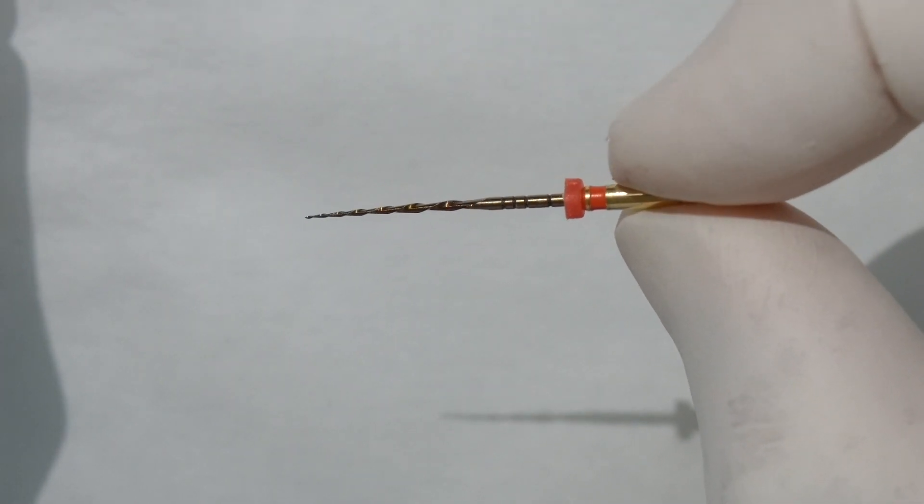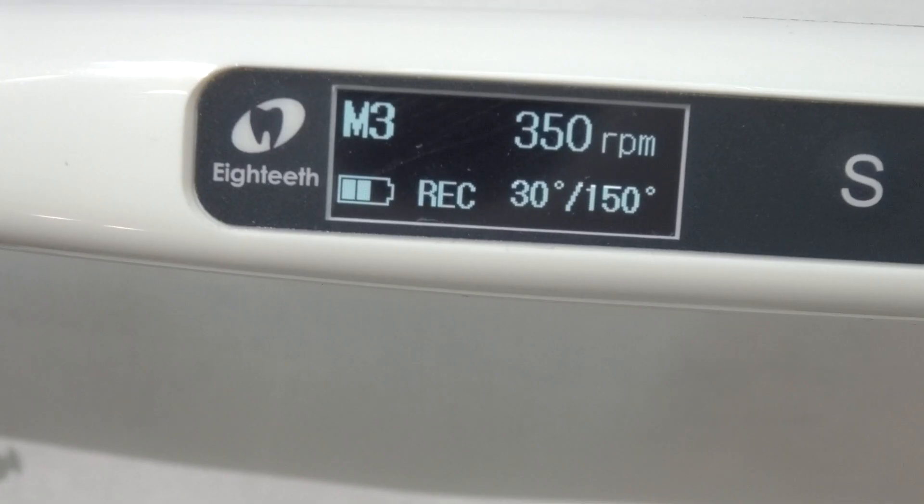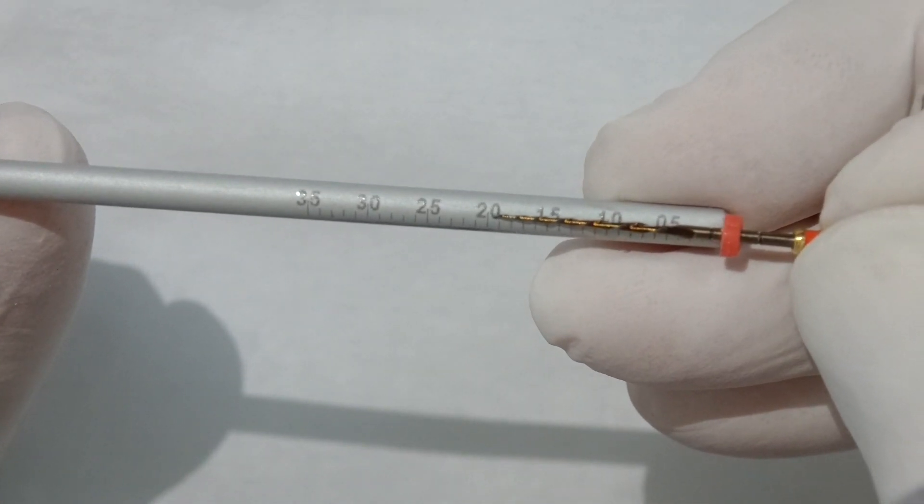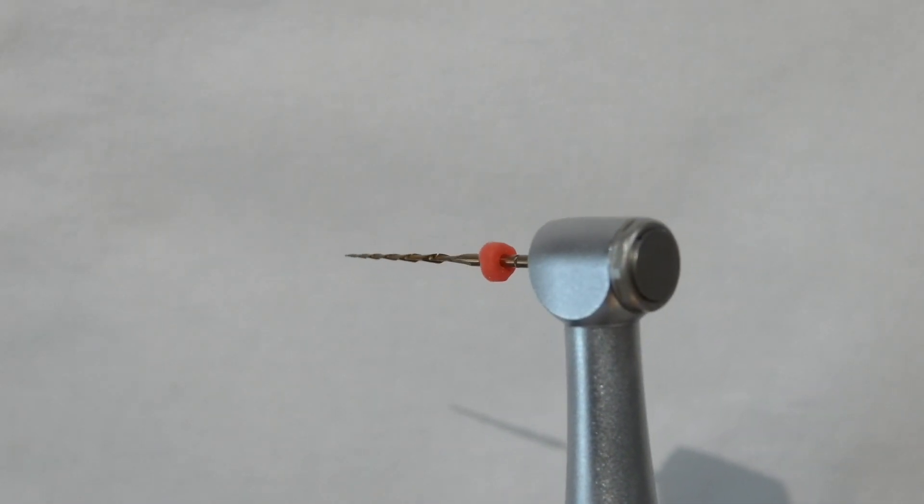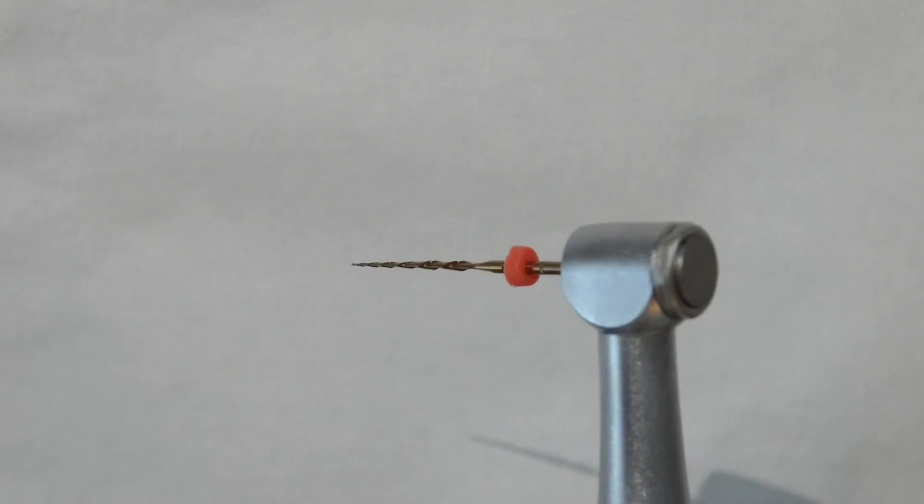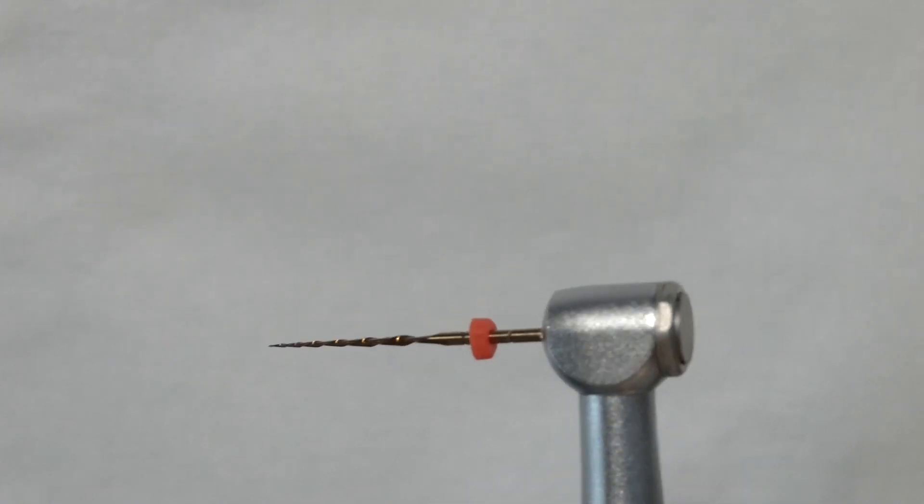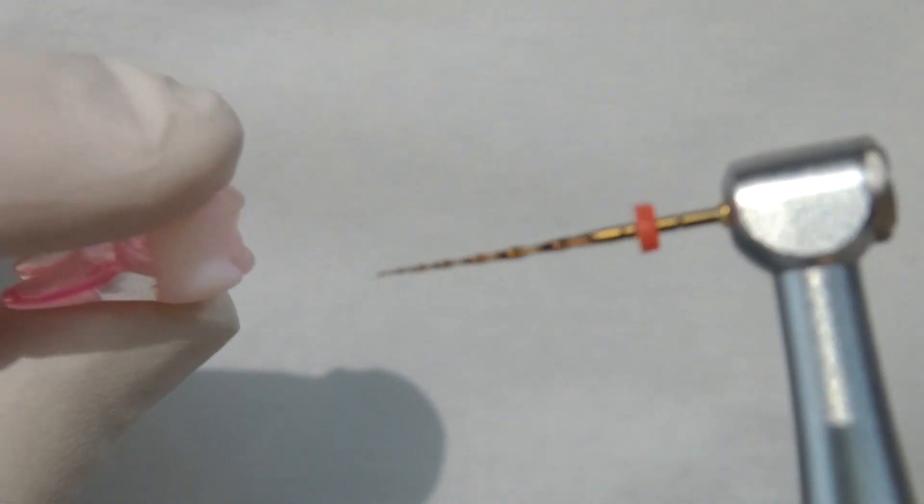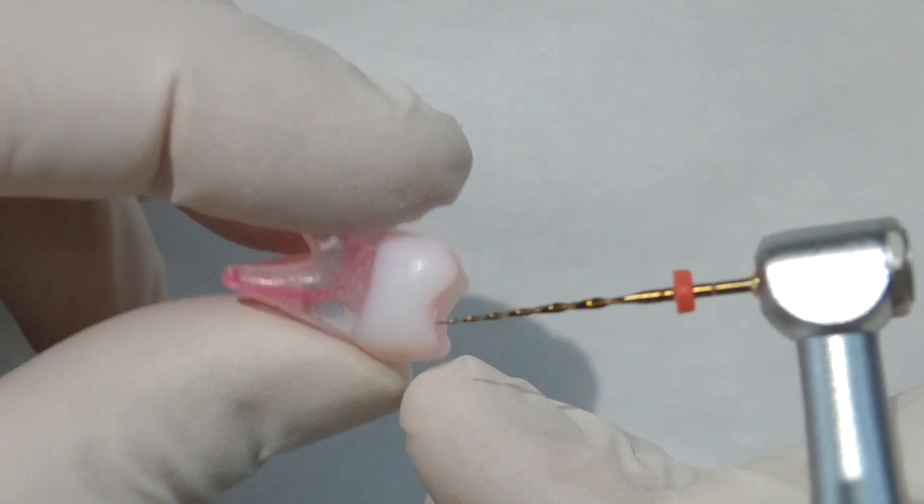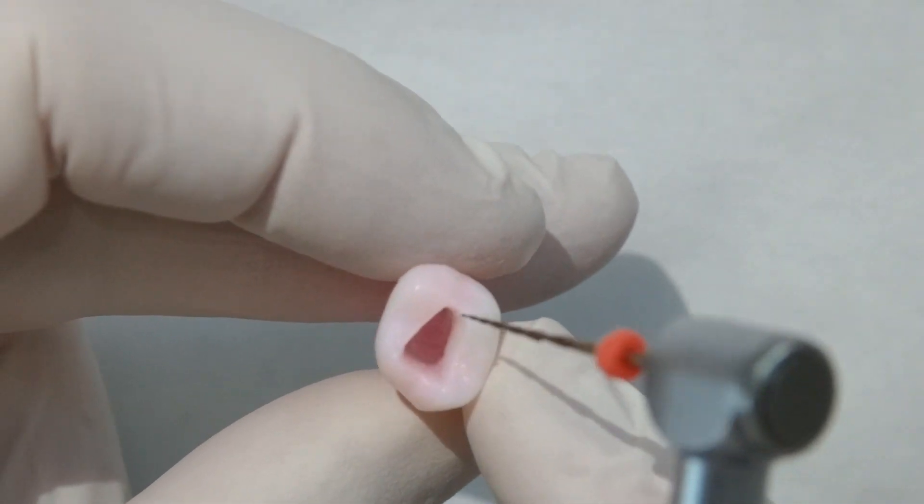This is our VFR file. It's a size 25. We put it on the same settings that you would run other types of reciprocating files on. So measure that to the working length. You can see it's got this oscillating action. It runs in reverse, so our cutting is 150 degrees anticlockwise, and then it gives that 30 degree unwind just to release any tension that might have built up in the file.